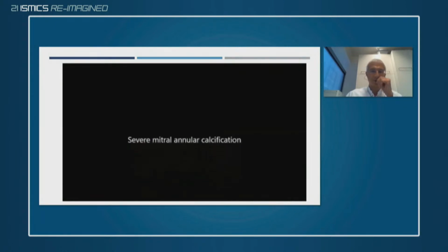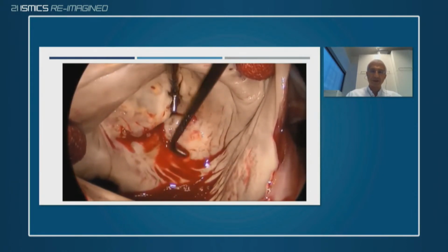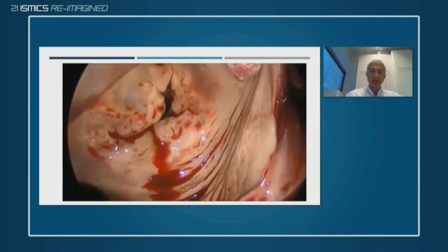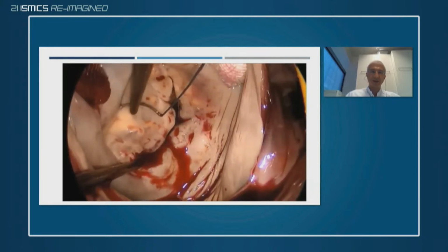We performed a simulation with 3D printing to see the effect of a potential transapical mitral replacement, and we saw that there was a high risk of LVOT obstruction. This was the intraoperative part. We identified the increased mitral calcification.